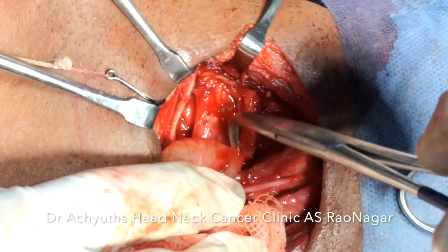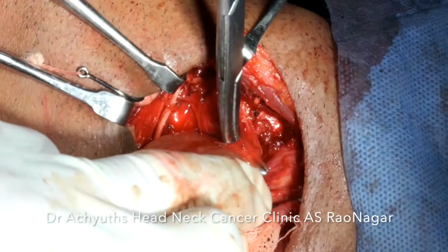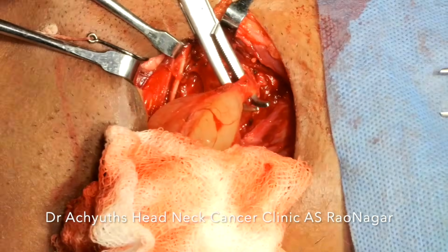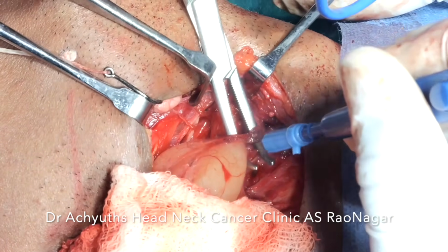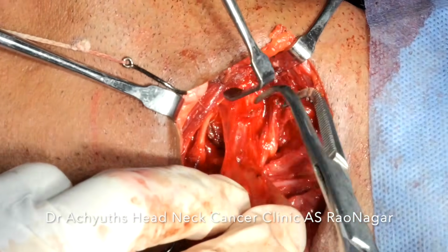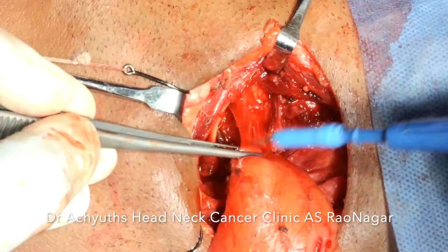Then actually this is one part of the surgery. The main part is again we have to reconstruct. Here the reconstruction is very straightforward. After the excision, we could identify the cut surface of the muscles, thyroid membrane, that have been reconstructed with the help of PDS suture.